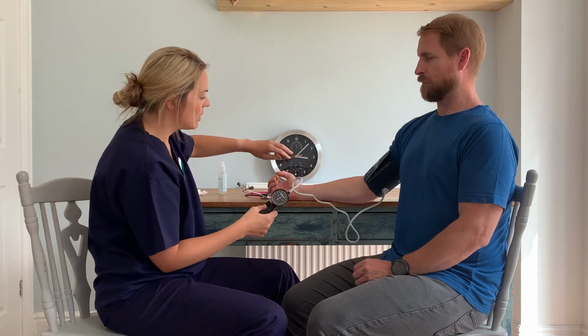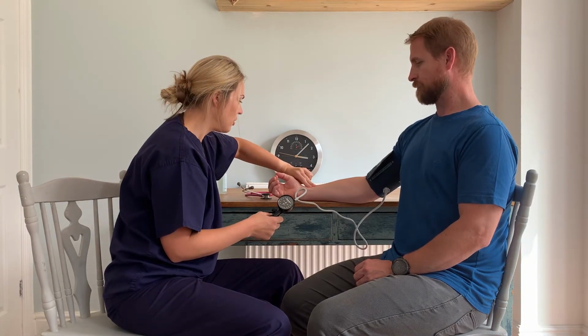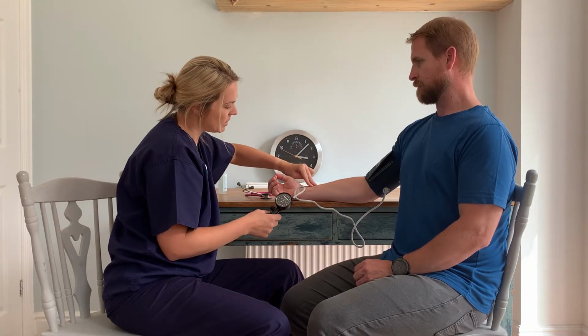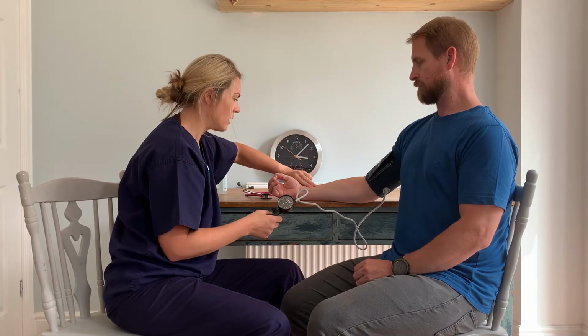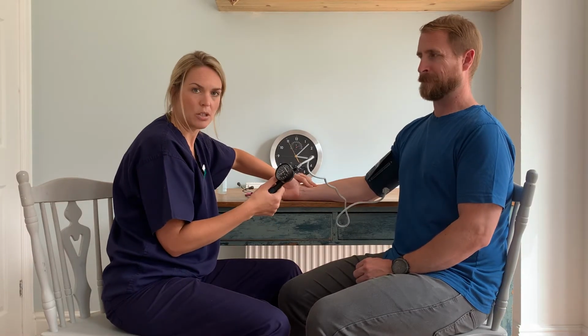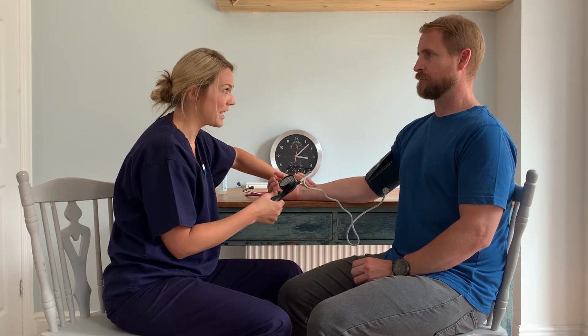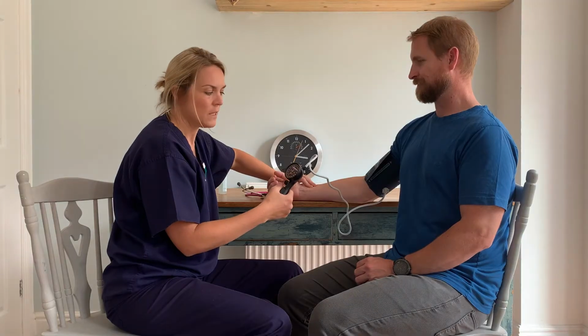So I'm going to find the radial pulse exactly like we did when we did the pulse earlier. So I'm just using 2 fingers, just a couple of centimetres up from the base of the thumb. You should be able to locate the radial pulse there. I can feel that nice and clearly. I'm now going to ensure the dial, the valve, is shut. I'm now going to pump up the cuff, just explain to my patient that it's going to get a bit tight around their arm, just for a moment. I'm just going to pump it up nice and slowly, and so I can no longer feel that radial pulse.